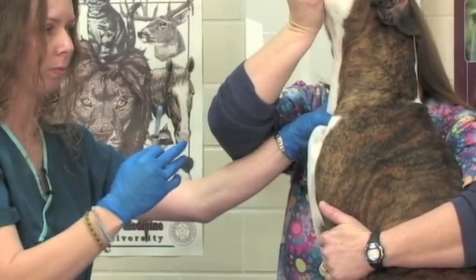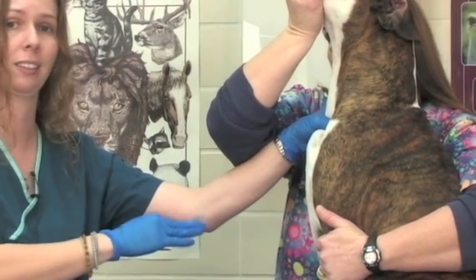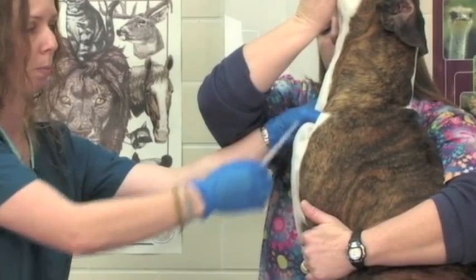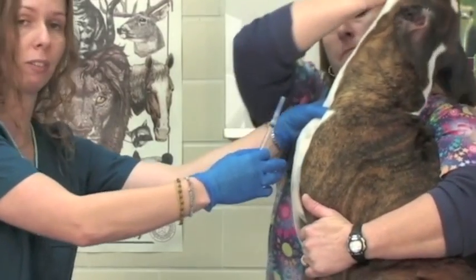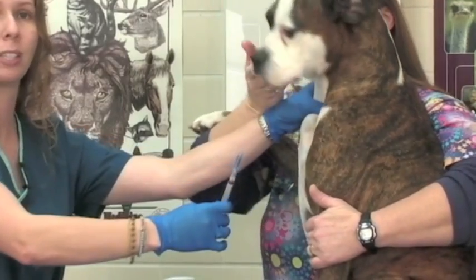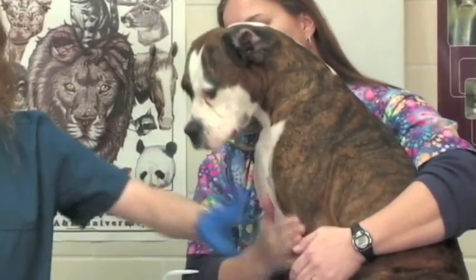From this point, the procedure for drawing blood is exactly the same as it would be from a leg or an arm. Put the needle into your patient with the bevel up at a 30 degree angle, and once you're in the vessel you can draw your blood sample the exact same way that you would from a front leg.